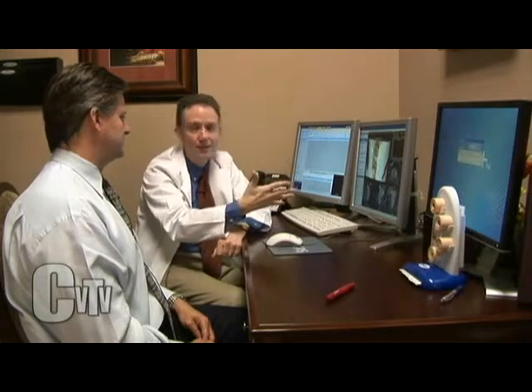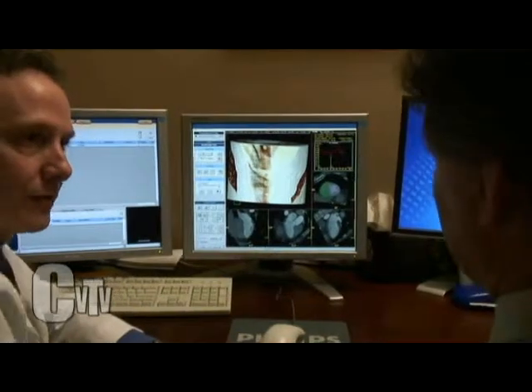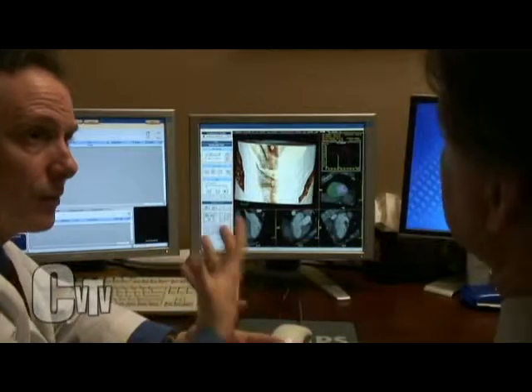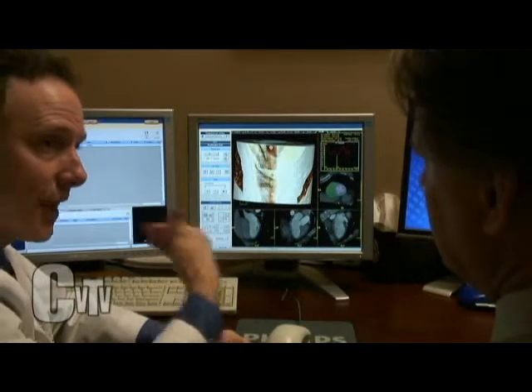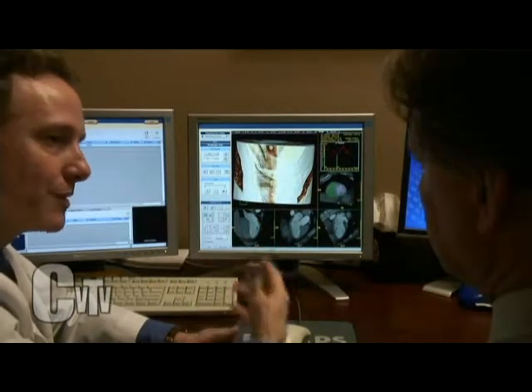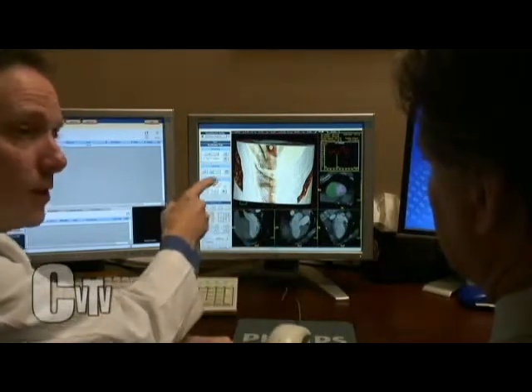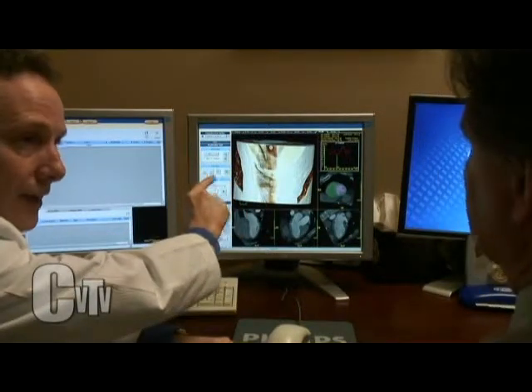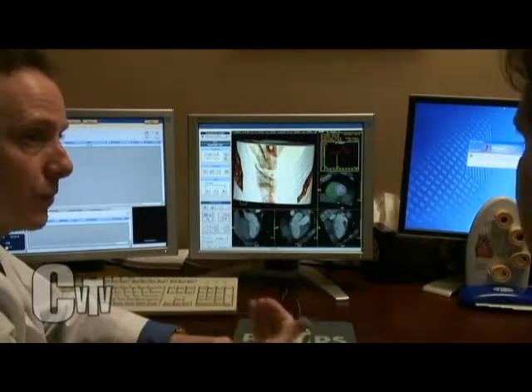And as I tell people, half of this is useful information for me. Do you have aneurysms, pulmonary embolism, things that you probably couldn't even say or spell? It's information to guide what's going on, what the problem is, and what we need to do to take care of it. But frankly, the other half of this tool is an amazing communication tool. I could tell you about aneurysms, pulmonary embolisms, coronary artery disease, plaque, and you go, what is this, what's it mean? But when I'm able to point it out and say, there's a baby plaque, there's atherosclerosis, what do you want to do with it? It's an incredible tool for both communication and motivation and compliance. It worked on me. I had plaque, took my medicine. I don't have plaque. I'm still taking the medicine because I know if I stop, I'll go right back to where I was. So why would I do that?